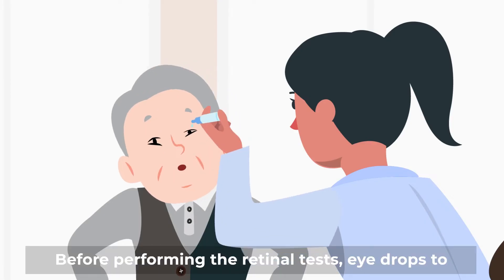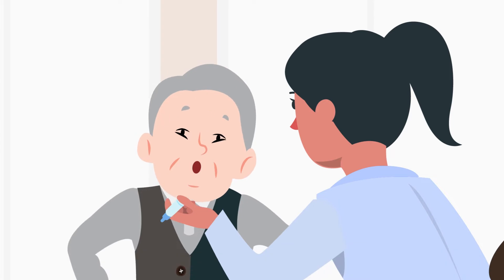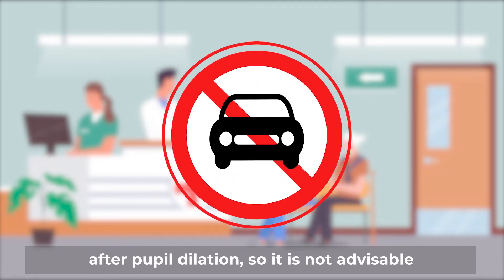Before performing the retina test, eye drops to dilate your pupil are required. Your vision will be blurred for four to six hours after pupil dilation, so it is not advisable to drive during this time.